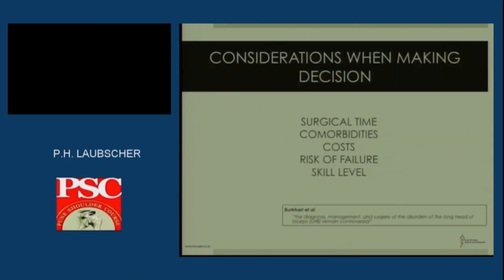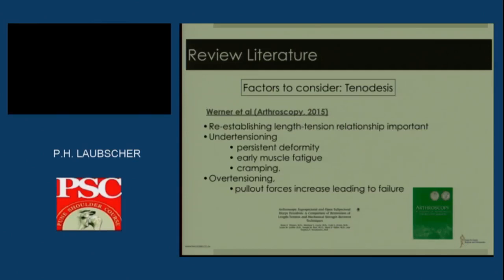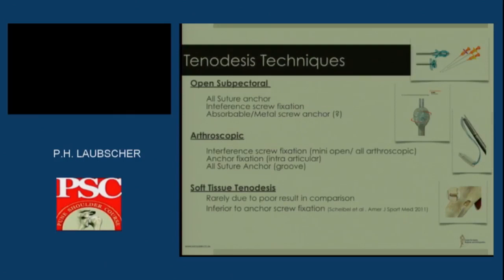Moving on, the considerations why I do this technique is time. I consider comorbidities, cost is a factor, risk of failure, and skill level. All of these factors play a role when you decide how you want to do your tenodesis. One of the things that I think is important is to consider the tension. As shown by Werner et al., under-tensioning causes deformity, muscle fatigue, and cramping, whereas with over-tensioning you can get a failure of your fixation. So those are factors that I think are important when you decide on your technique.